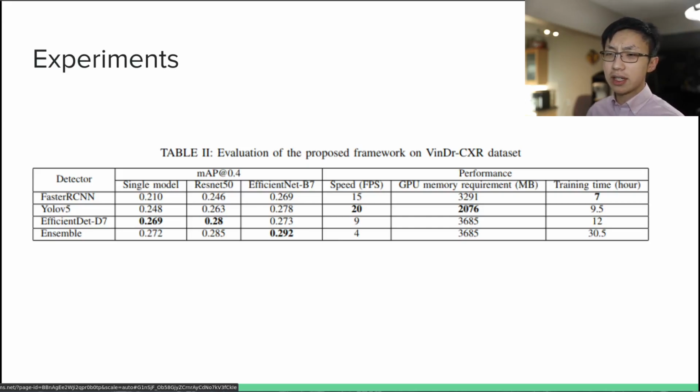So after all of this, why trust our scores? How are our scores real? The test set for VinDr-CXR is withheld, meaning that we must submit our models in order for them to be evaluated. In this case, we submit our code to Kaggle for evaluation on their servers. Our model produces predictions on images, and they are evaluated completely by Kaggle. All of the previous mean average precision scores were scored this way. We locally cross-validate using stratified k-folds to select models, but our final findings are presented with this official score.